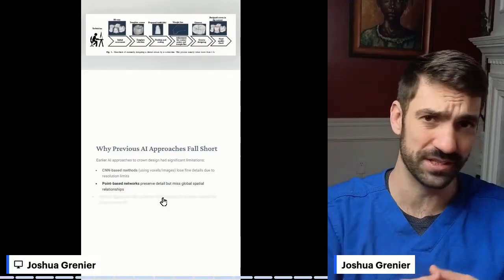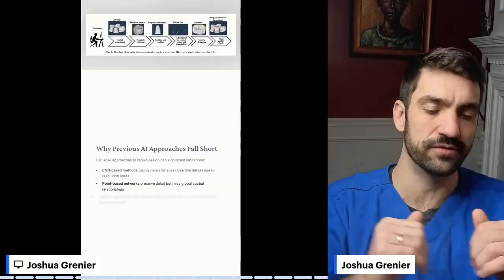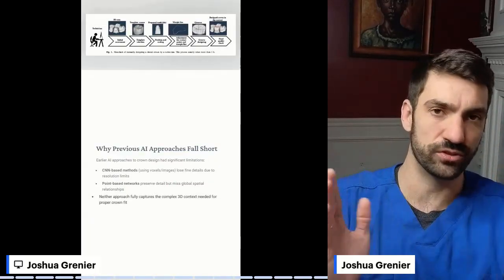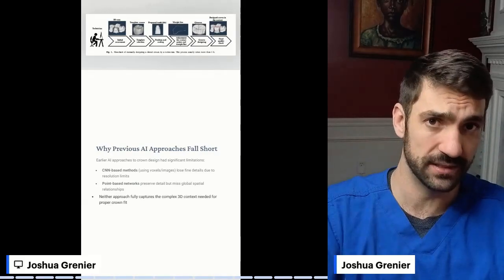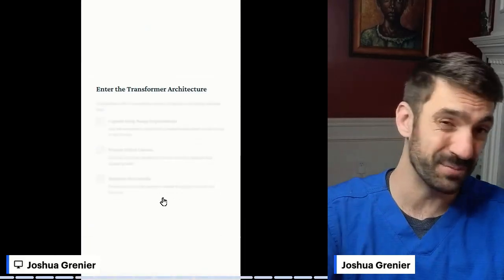A lot of the older ones like Sirona were very effective, but they used almost an algorithmic way of generating this. And a lot of other approaches like Three Shape use a hybrid approach where they're using a subtractive method of the surrounding structures to still generate a shape that is functional, that works. So they're supplementing the generative approaches, which can work very well and can be done quite quickly.